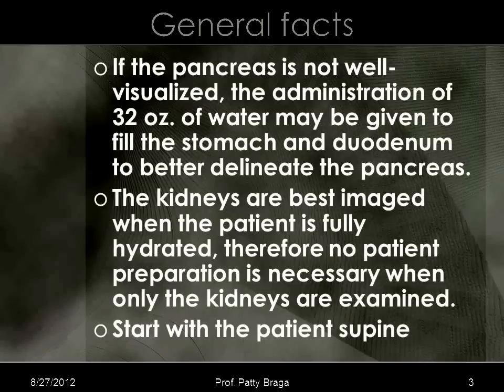Most of the general facts we have already gone over, so this is more of just a review for you. But I wanted to touch on the NPO, which is something that we do for abdomens. The main purpose, as stated in the slide, is so that it reduces the amount of gas a patient might have after they eat, and also when a person eats, the gallbladder empties, so that it can help in the digestive system. By keeping them NPO, it allows the gallbladder to fill so that we can see it.